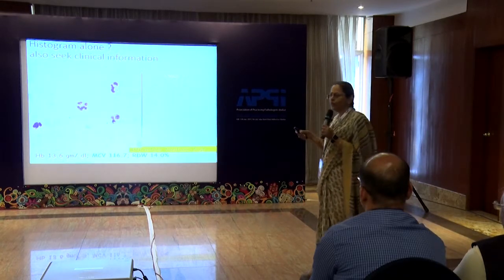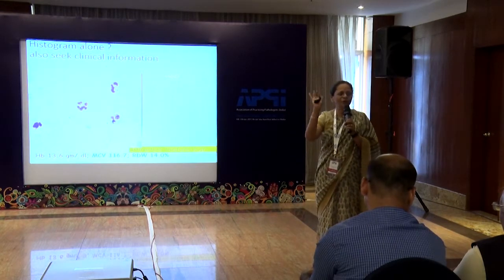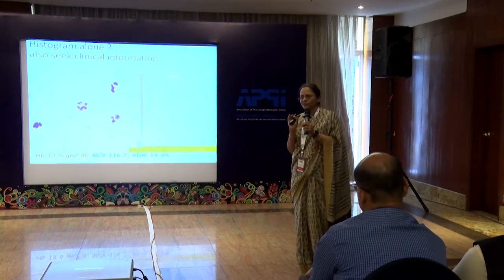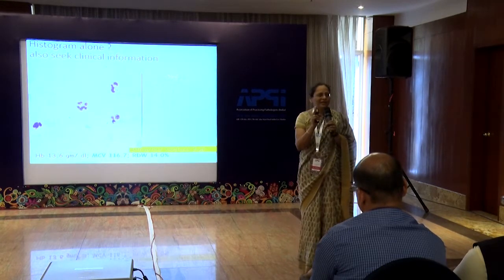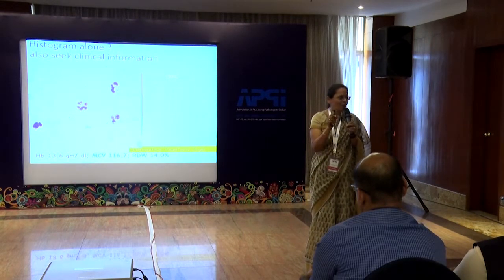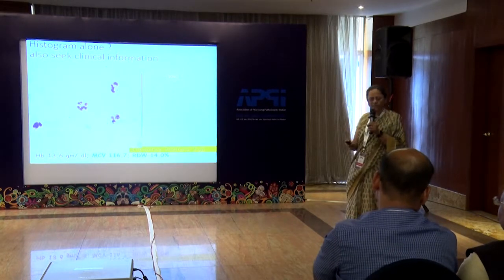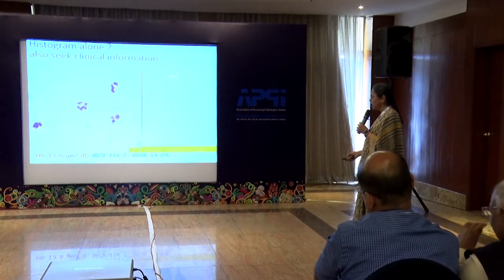So when you pick up something, whenever there is a discrepancy, rule of thumb, whenever people don't agree, it means there is scope to negotiate and get to the truth. If people don't agree, that means it is neither black nor white. There is something in between. And unless you go look for it, you won't find that shade of gray. When there is a discrepancy, you must go beyond what is given to you. You'll find that it's because the patient has already been transfused.